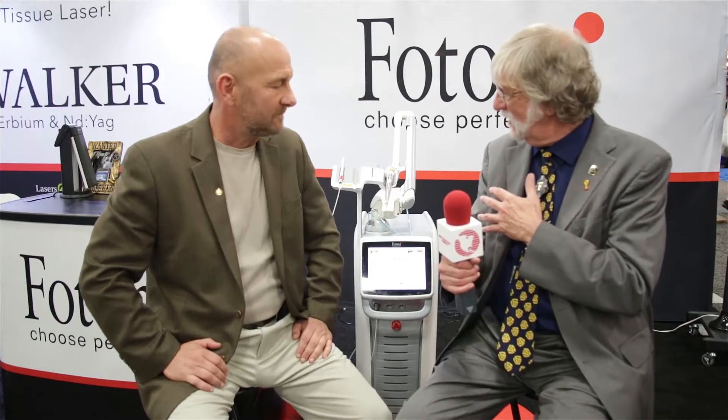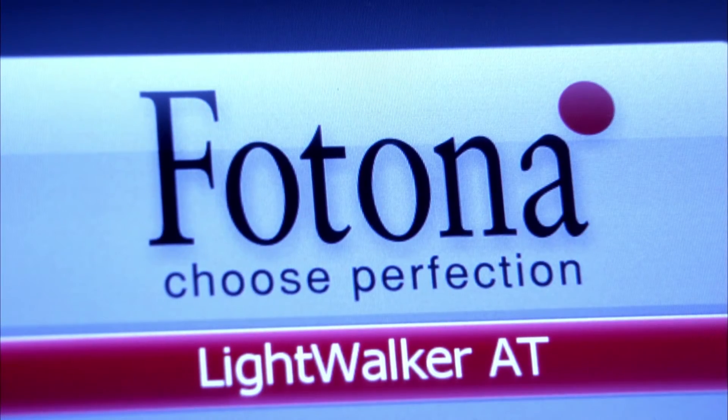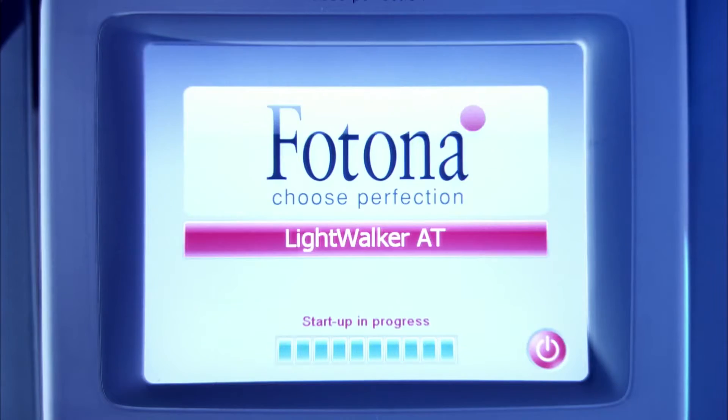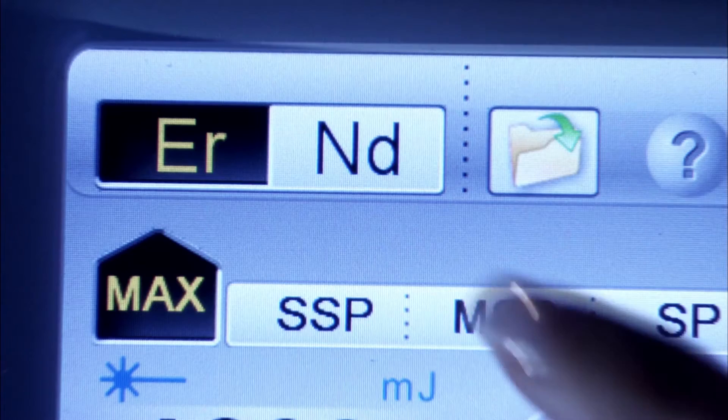Hey, this is Paul Feuerstein, technology editor of Dentistry Today, and I'm here with my good friend Mark Malterud. Mark, how are you doing? I'm doing great, Paul. So we're sitting in front of an interesting laser here. It's the Fotona company's laser called Lightwalker ATS, if I'm not mistaken. It seems to do a lot of things, but I'd like to get a rundown here, Mark, on what's going on.